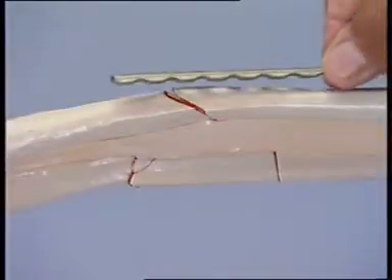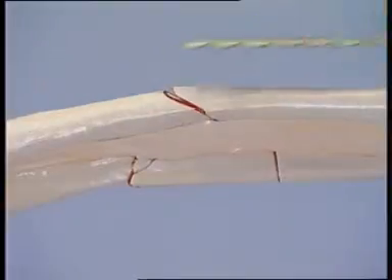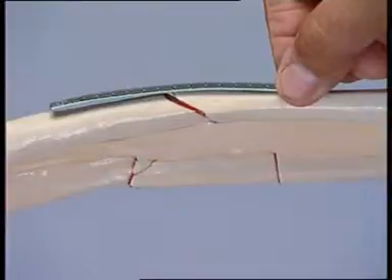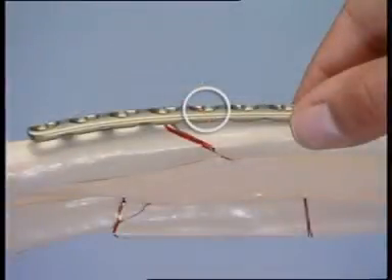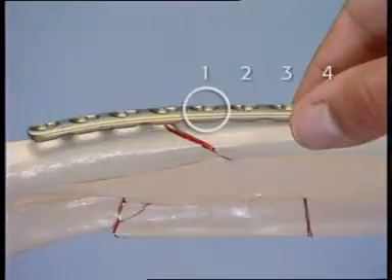The radius is slightly curved, so the plate must be contoured. The bending template helps to obtain the correct curvature. Choosing an 8-hole LCP requires that the appropriate plate hole already be selected for the interfragmentary lag screw that will be inserted across the oblique fracture. Three holes will lie over the proximal fragment and four over the distal fragment. One hole is left free for the lag screw.